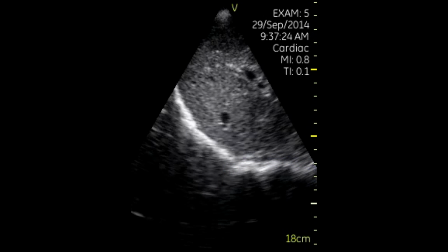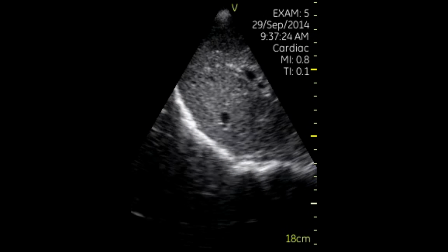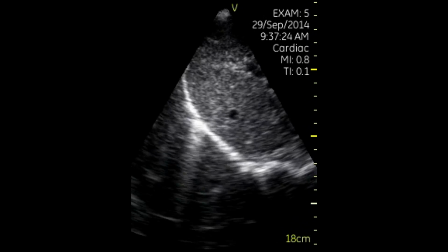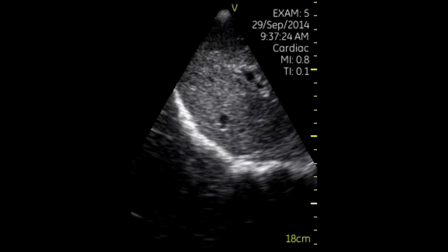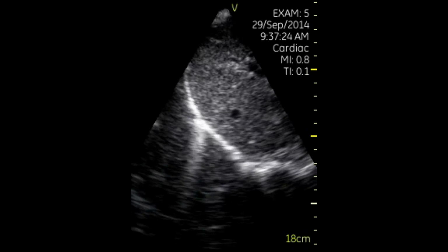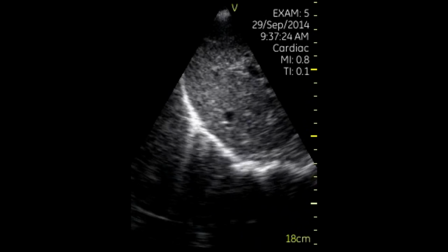In this image, the liver is seen caudal to the diaphragm, with a mirror image artifact of the liver seen cephalad to the diaphragm. This suggests a normal air-filled lung. Note that during inspiration, this mirror image artifact moves caudally and obscures the vertebral bodies. This artifact pattern is sometimes referred to as a curtain sign and suggests absence of a pleural effusion.